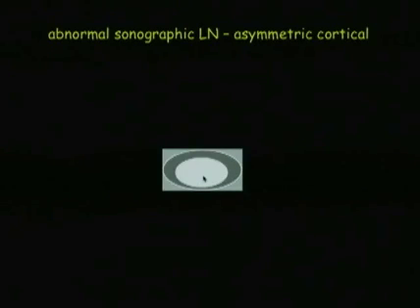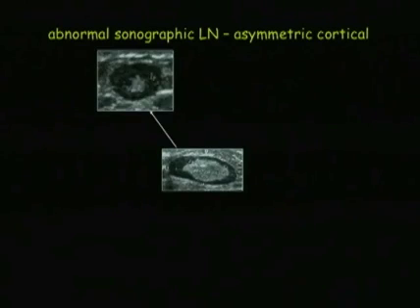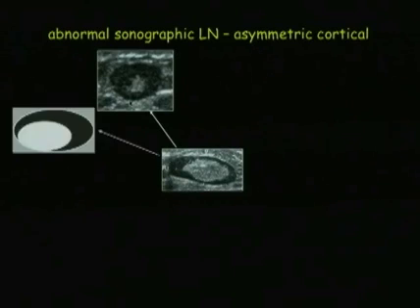This is sort of an illustration of when we need a tiebreaker and when we don't. In the center, I've shown a normal lymph node. In the left upper corner, I've shown symmetrical cortical thickening, and I've put a little white outline around this, meaning that it's nonspecific. This could just as likely be a reactive lymph node as it could be a metastatic lymph node, so I'm going to have to rely on a tiebreaker.